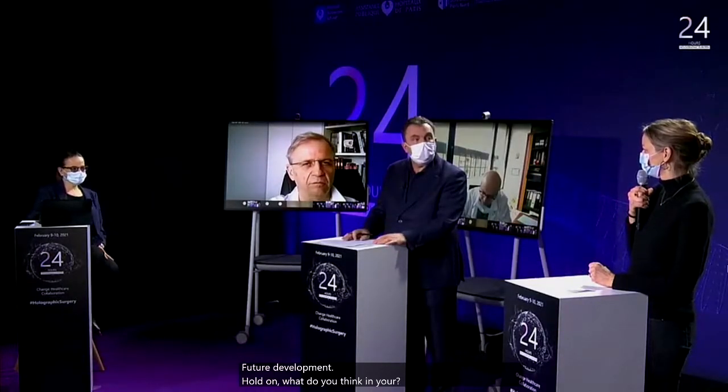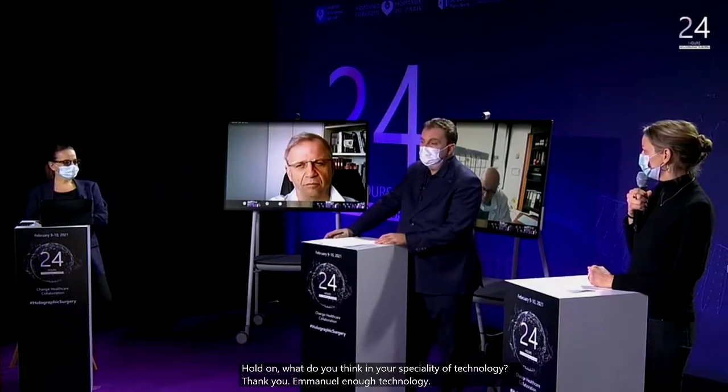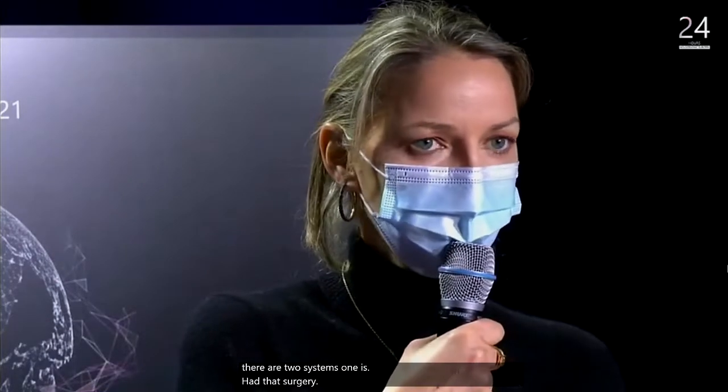Audrey, what do you think in your specialty of ophthalmology? Thank you, Emmanuel. In ophthalmology, currently we have two kinds of devices in the operating room. There are numerical interfaces between the patient and the surgeon. And this allows us to be not just behind the microscope as usual, but there are two systems. One is heads-up surgery. So we are in front of a screen, seeing the inside part of the eye in 3 dimensions. This system is already commercialized.